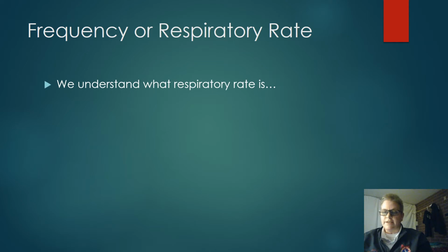How many of you have seen and used, as I have, crash ventilator settings? I didn't know much about this stuff, but it's grossly inadequate to put a tidal volume of 500 and a respiratory rate of 10 on a patient whose oxygen demand has gone up. There's an insult to their body. They're going to need more oxygen. We just put them on a vent circuit that's going to take out about 150 mils of that air getting down into those alveoli.